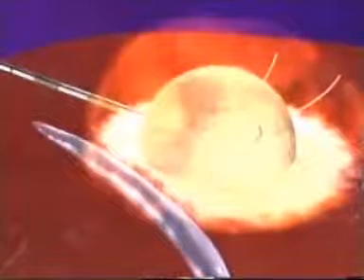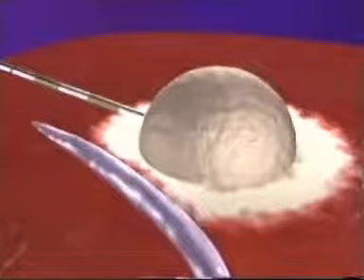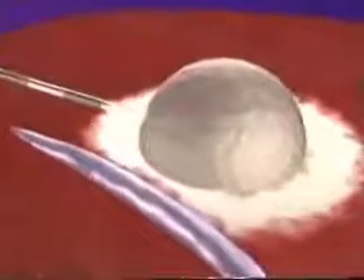Or it could be left unchanged with the understanding that if adequate temperatures are not achieved, the area near the vessel may not be completely ablated. Often, if the vessel is smaller than 3 millimeters, it will eventually coagulate, at which point the temperature will rise rather quickly.